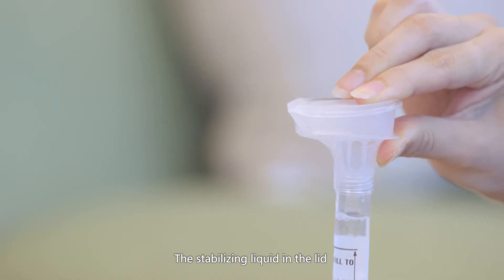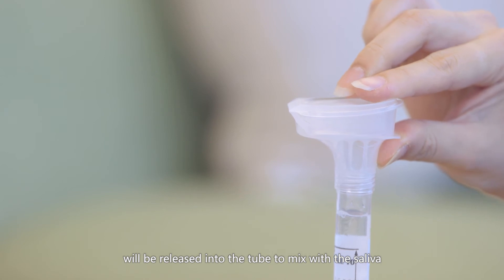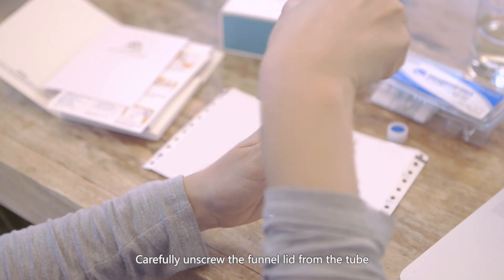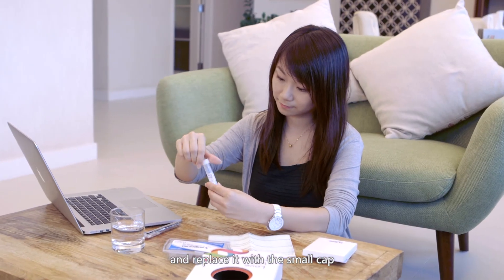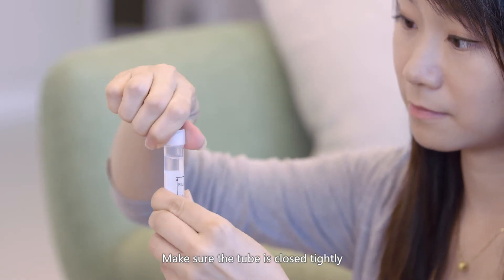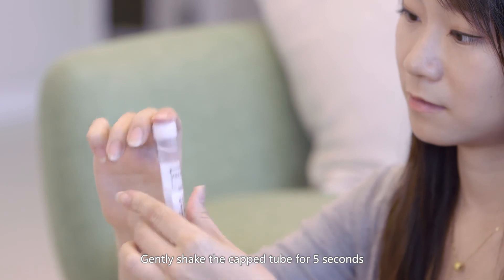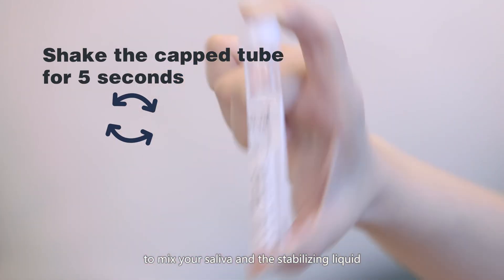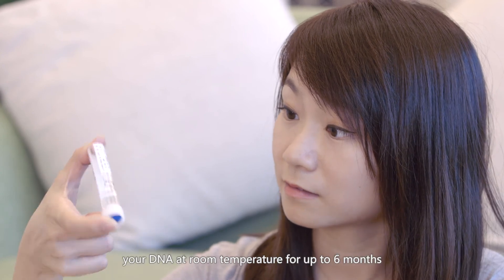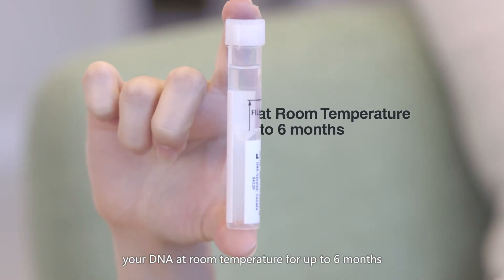Hold the funnel lid with the other hand by firmly pushing the lid until you hear a click. The stabilizing liquid in the lid will be released into the tube to mix with the saliva. Carefully unscrew the funnel lid from the tube and replace it with the small cap. Make sure the tube is closed tightly. Gently shake the capped tube for 5 seconds to mix your saliva and the stabilizing liquid.